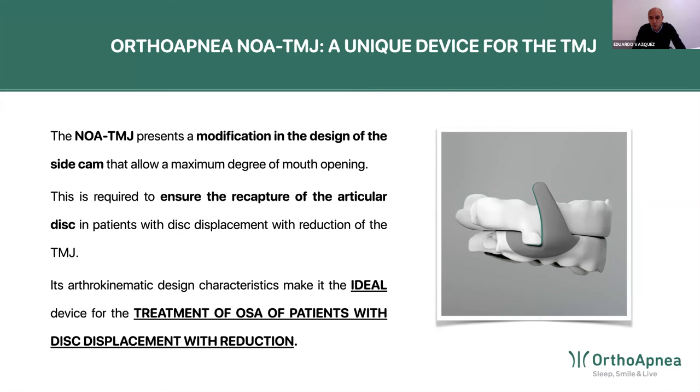So there is mouth opening control. And actually the maximum height of the cam is around 13, 14 millimeters of opening. And as I said, I've treated almost 30 patients with combined problems.